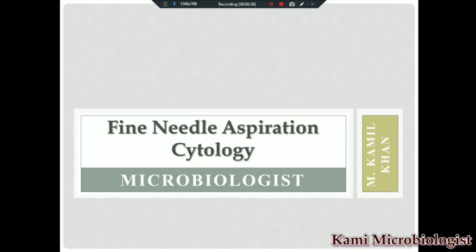Now fine needle aspiration cytology, or we can say fine needle biopsy, both are almost similar to each other, but in case of aspiration we take the fluid, and in case of biopsy we take the tissue portion. In both cases we mostly study the cancer cells. So in this video we are going to see what fine needle aspiration cytology is and how we can perform it, the procedure, staining, purpose, everything. So let's start the video.